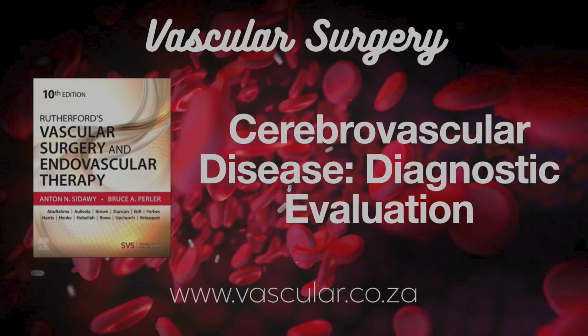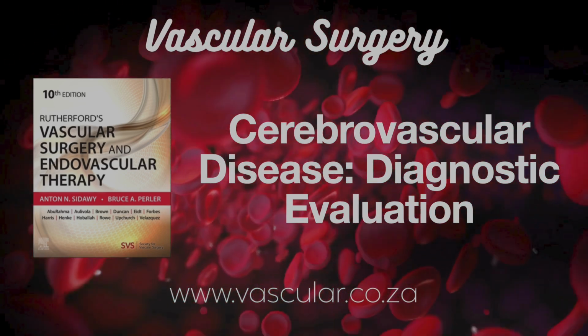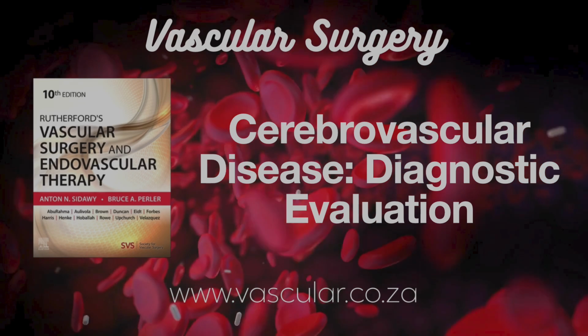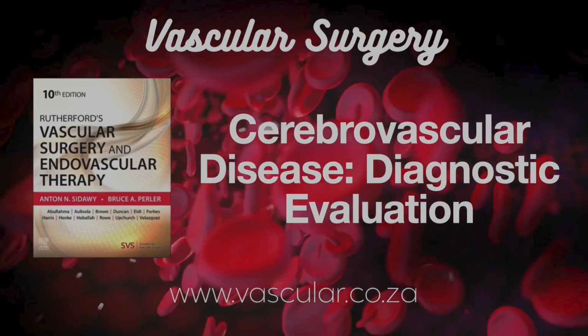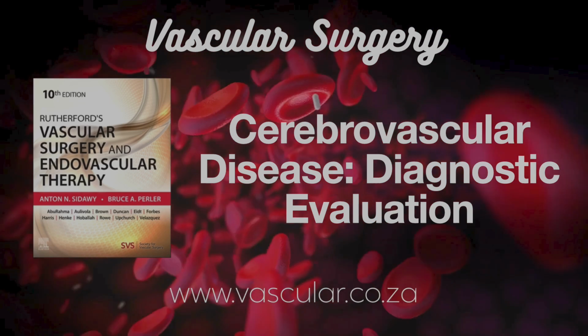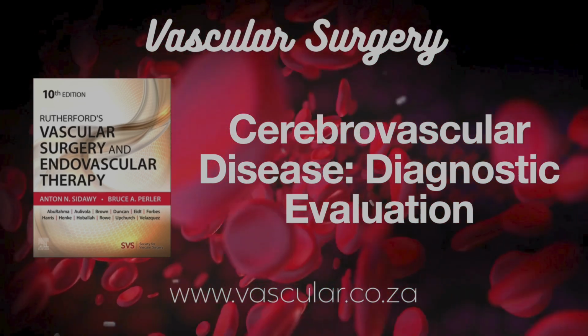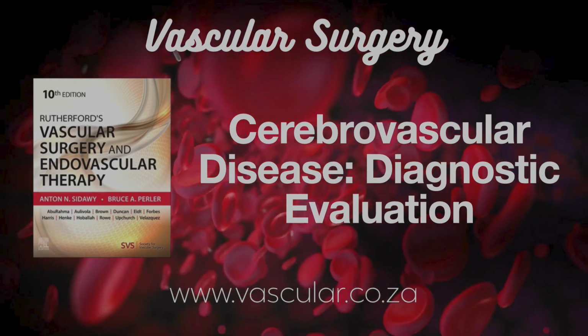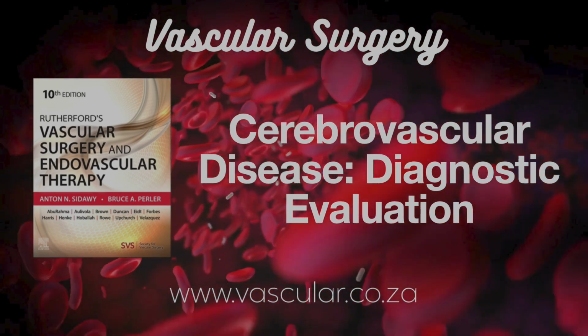So in those centers where TCD is available, finding these MES in an asymptomatic patient might actually push clinicians towards recommending intervention, like a CEA, sooner rather than later because it flags them as being at much higher risk. Fascinating. A potential window into plaque activity and immediate risk. Okay, we've covered a lot of tech. How do doctors actually put all this together? What are the clinical guidelines for using these tools?